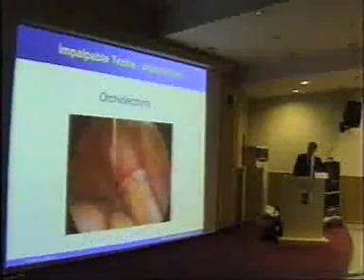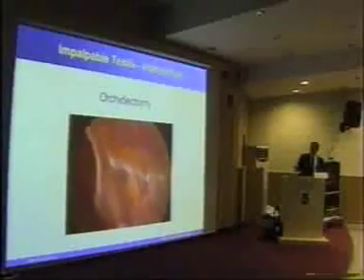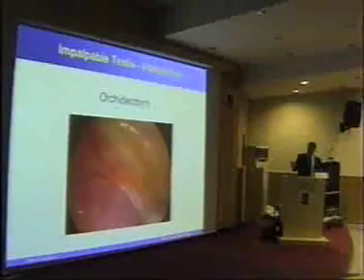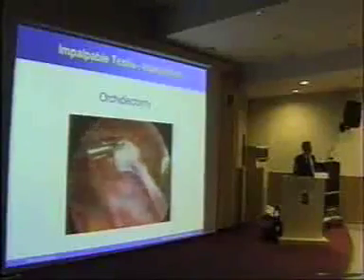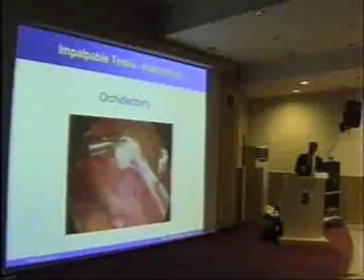But it's also a good group of patients in which you can move on to the next phase. This is a patient with a blind ending vas here. Looking around on the psoas tendon, the psoas muscle here, just on the body of the psoas, look, there's a dissociated testicular body, a dissociation of the testis from its collecting system.